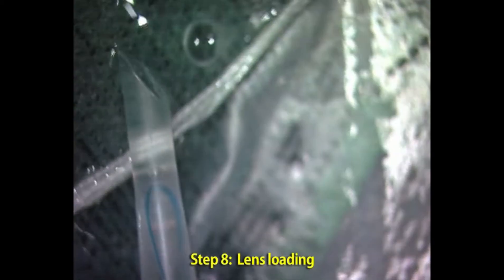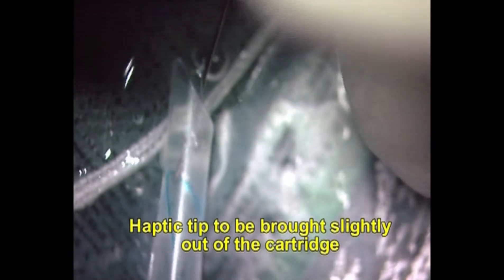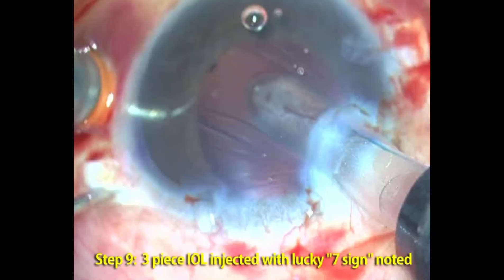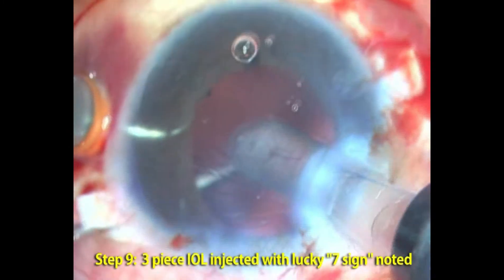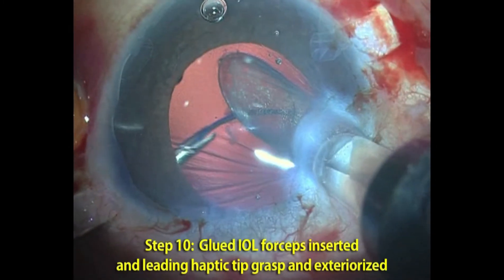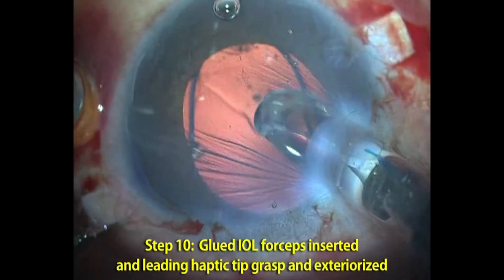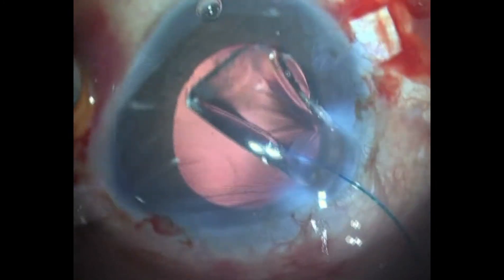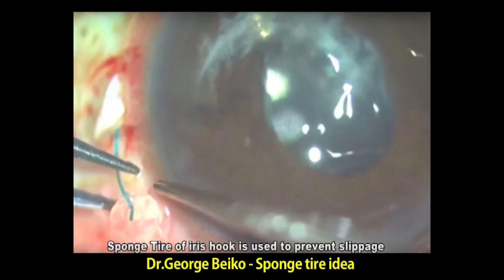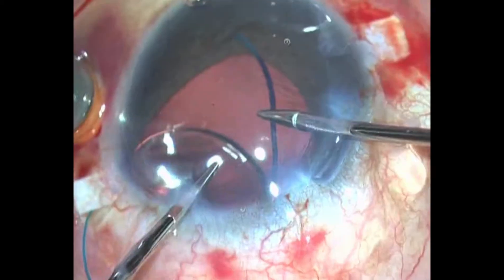A three-piece intraocular lens is loaded into the injector and one haptic is brought out so that the tip is seen outside of the cartridge. Using the glued IOL forceps, which goes through the 22 gauge sclerotomy, we call it the Lucky Seven sign — one haptic is coming out and the glued IOL forceps holds on to the tip of the haptic and brings it out, leaving it on the sclera.